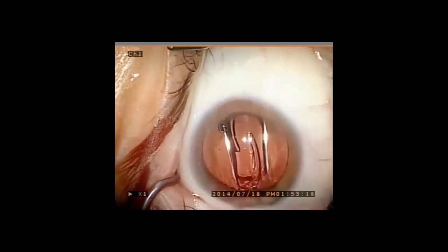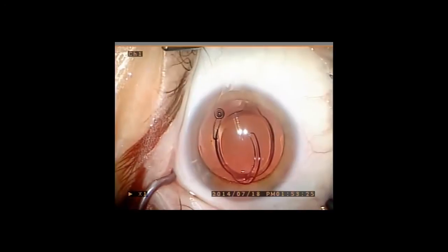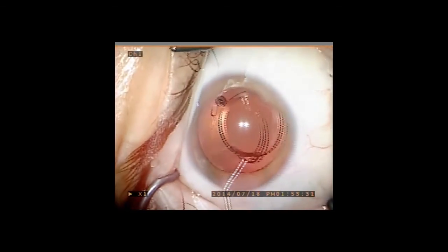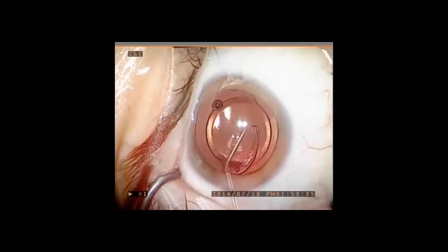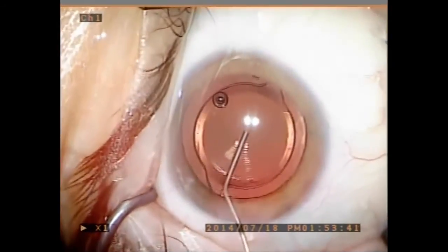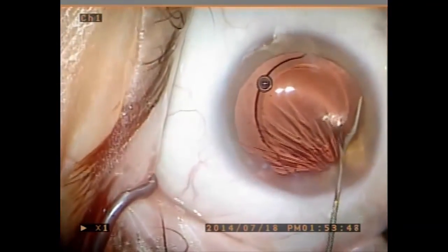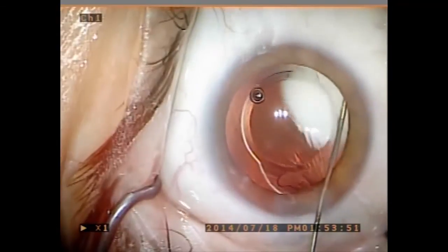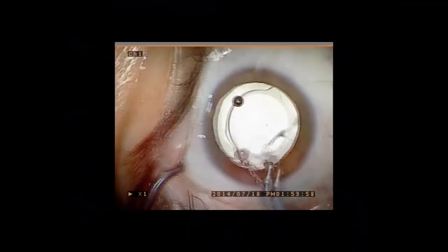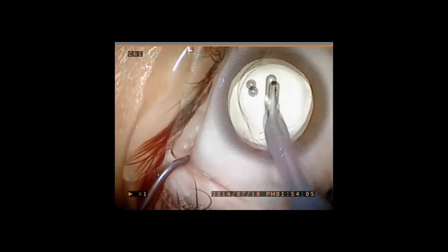The last case demonstrates that with experience and a widely dilated pupil, viscoelastic is not needed to expand the sulcus for TMV delivery. An AMO-Technus ZMBU multifocal lens is placed into the capsular bag. The cannula then enters through the zonules by posteriorly rotating and slightly depressing the distal segment onto the peripheral capsule, with clear visualization of the capsule edge. Once the TMV is injected into the anterior vitreous, a plume should be visible. If it is not, then the drug is either in the anterior chamber or trapped under the equatorial iris. At this point, I would repeat the injection only one time.